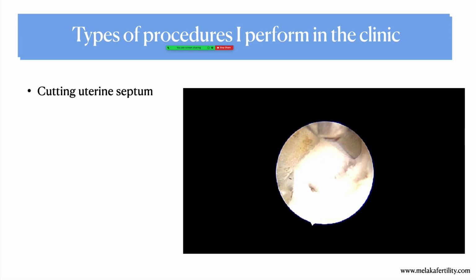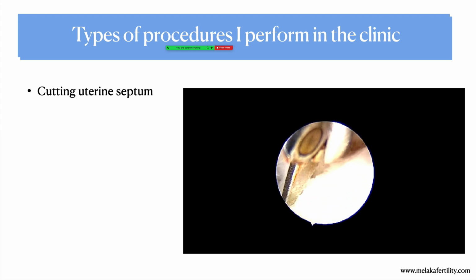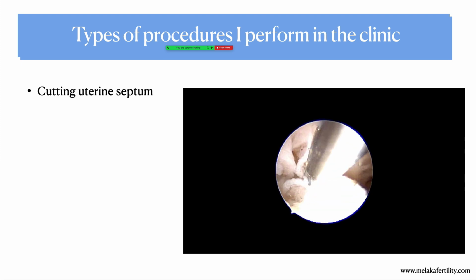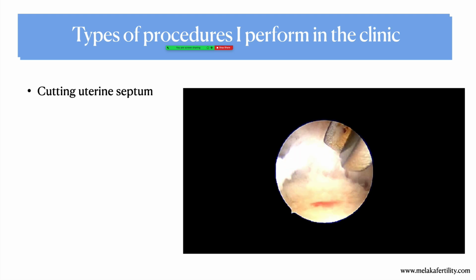Current thinking is actually excision, but the advantage of doing this is I can do as much as I can, and I can bring the patient back in a month's time and repeat the procedure. That's a big advantage as opposed to the patient going under general anesthesia. This is quite a large septum with a lot of tissue. So I did it because the patient asked me to do it under an office setup.